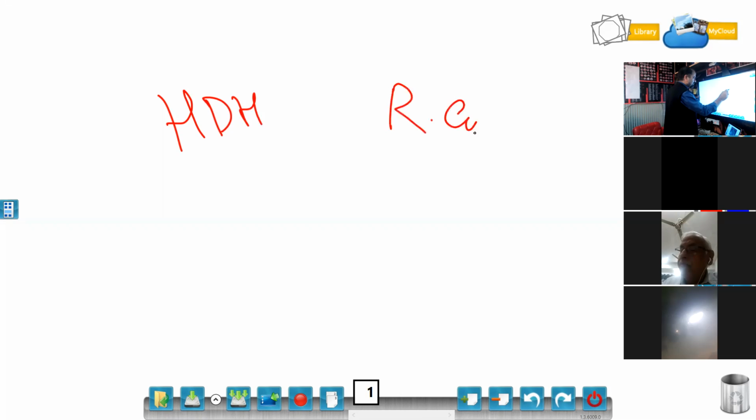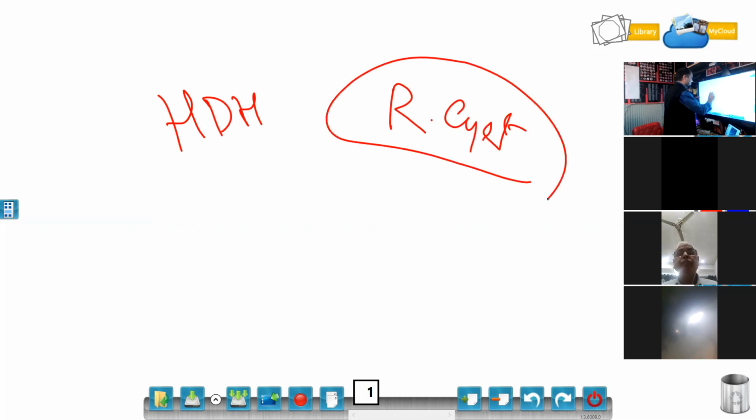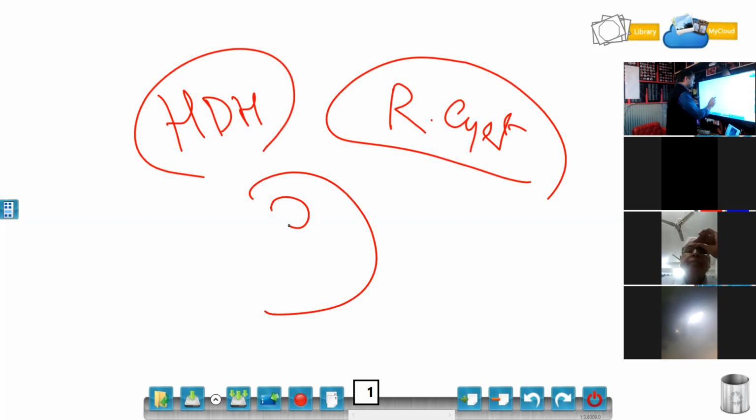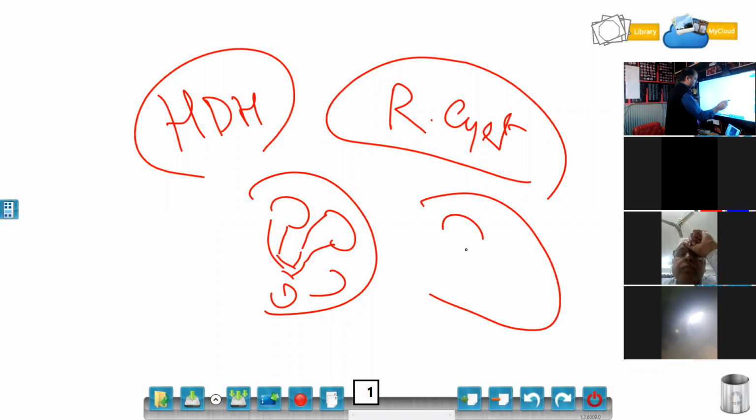Now, as we have touched on hydronephrosis, it can be confused with renal cysts, especially multiple renal cysts can be confused with hydronephrosis. So C for the communication. If this is a hydronephrosis, this will look like a cyst, but you have to look for the communication, and these will communicate. In the case of renal cysts, the cysts do not have any communications.